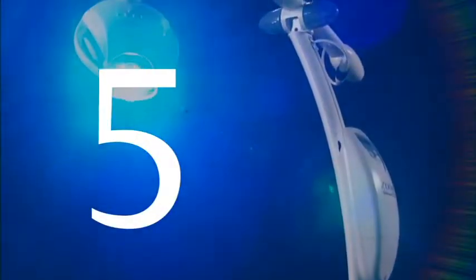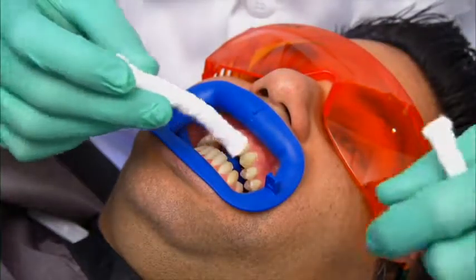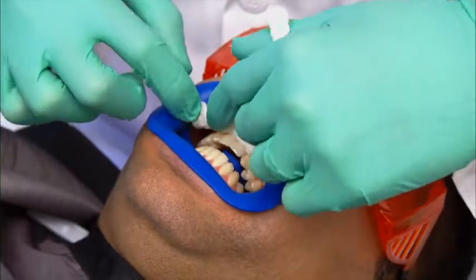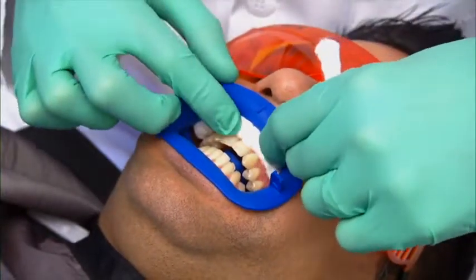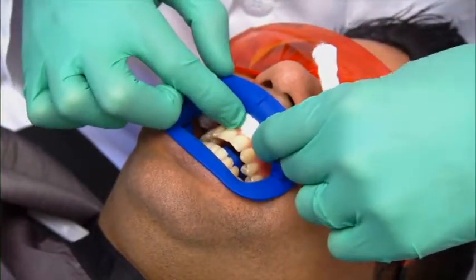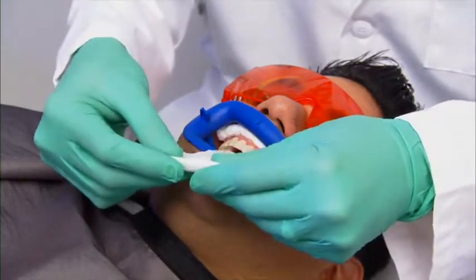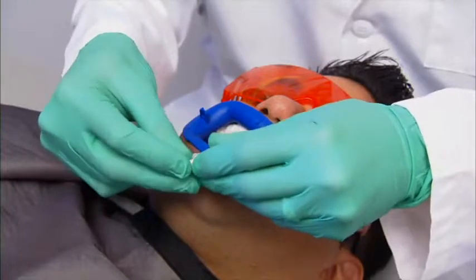Section 5, Isolation. Begin isolation by placing cotton rolls in the center of the upper and lower vestibules. If the cotton rolls are too large, unfold the provided gauze and twist in the shape of a cotton roll.